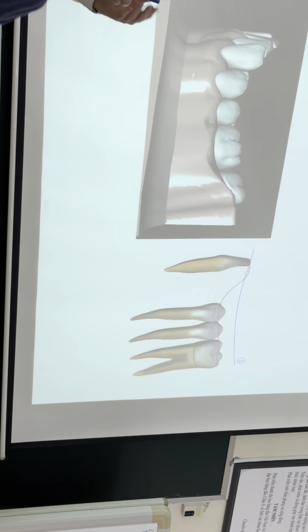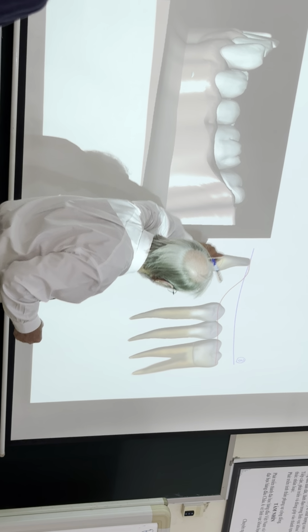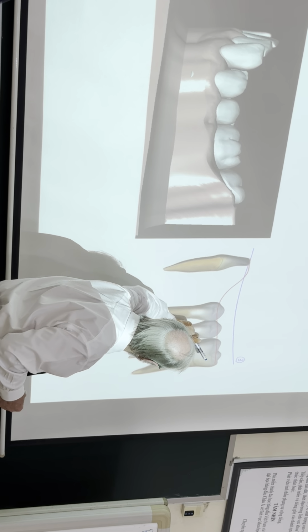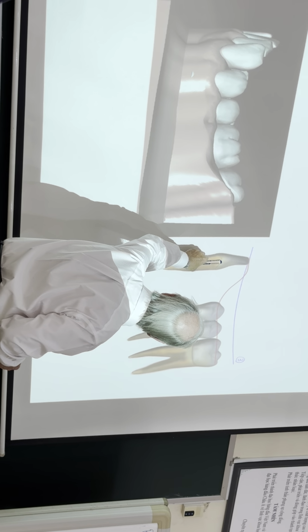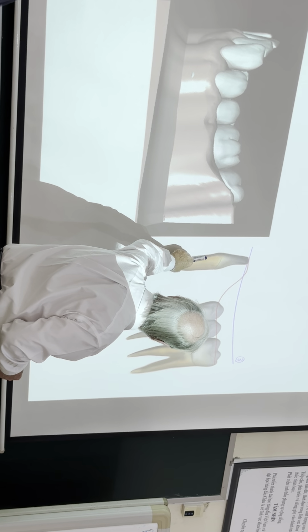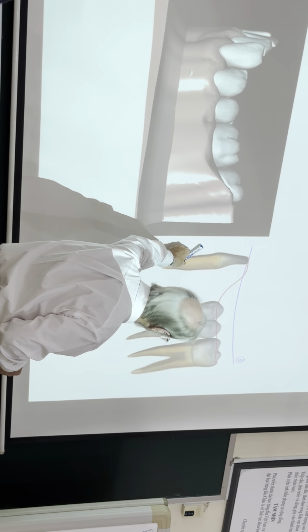What happens, which is really cool, if you can disclude the patient that I showed here, these teeth will tend to extrude, with an attachment or whatever. You bring them up, and at the same time you push here, and the tooth will slowly intrude and maybe tip a little bit. If you just push on this tooth this way, you're going to tip it.